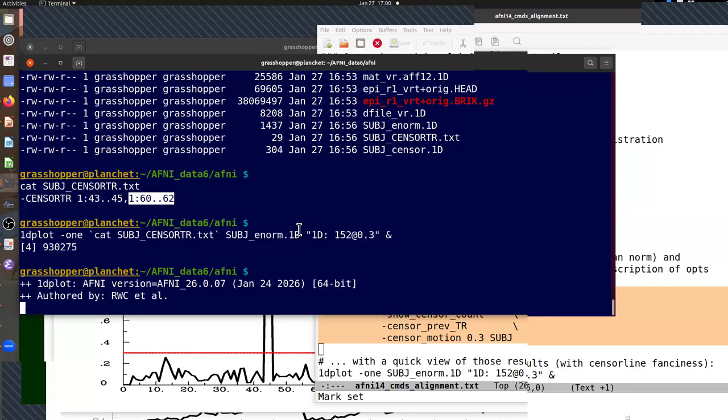Yes. Sure, I'm not sure what more to say other than it exists, and there are two ways you can do phase distortion correction for EPI volumes. You can acquire what's called a phase map, which is basically something that, as it gets further away from zero, is telling you where there was more EPI distortion. And you can actually use that as kind of a warp field directly.